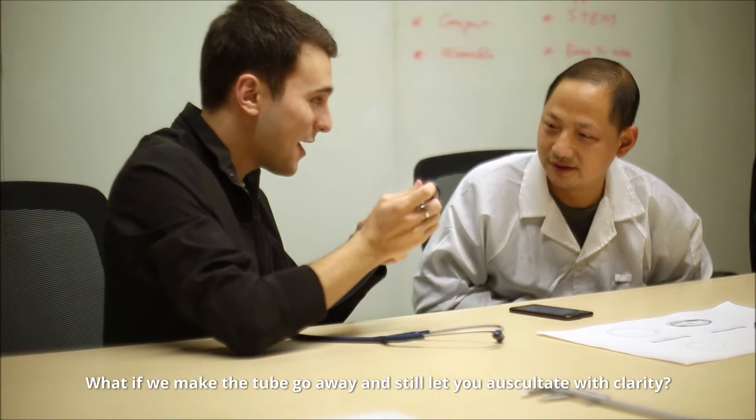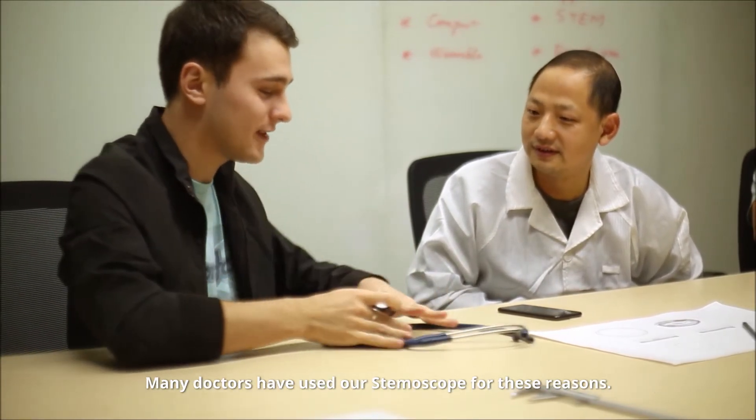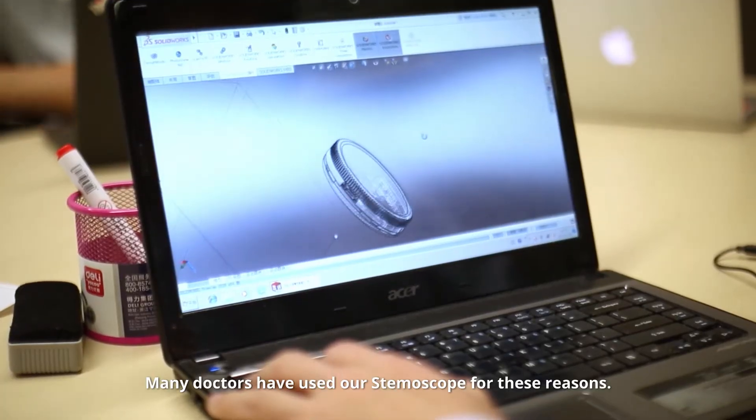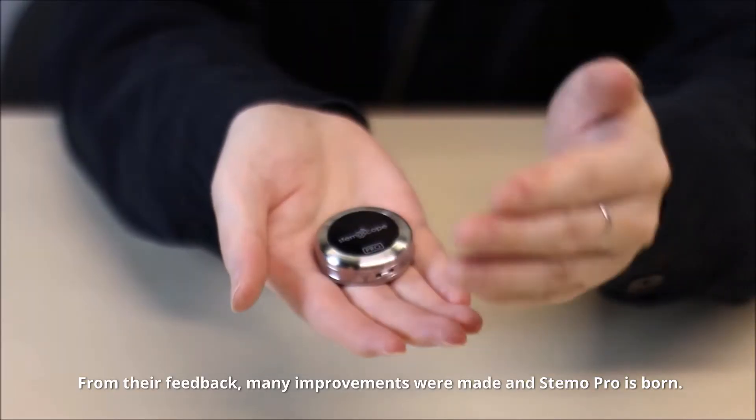What if we make the tube go away and still let you auscultate with clarity? Many doctors have used our Stemoscope for these reasons. From their feedback, many improvements were made, and Stemo Pro is born.